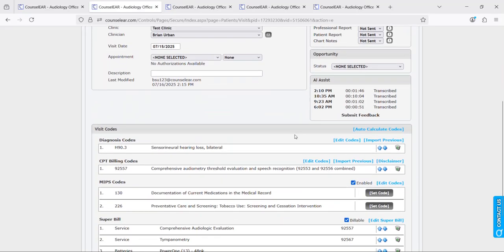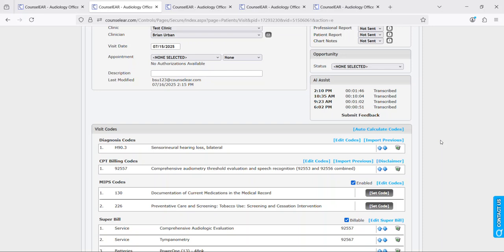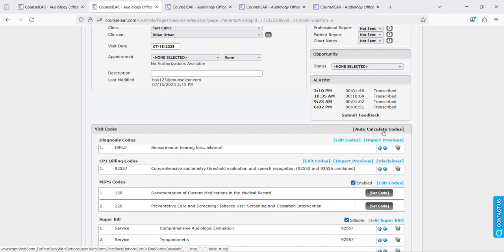Once you have applied the data, if there are codes in place they will land in the super bill area. If you also have audiologic data in Counselor, like you sent it over from NOAH via Synergy, then you may also want to click auto calculate codes.